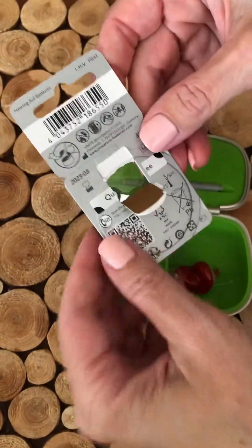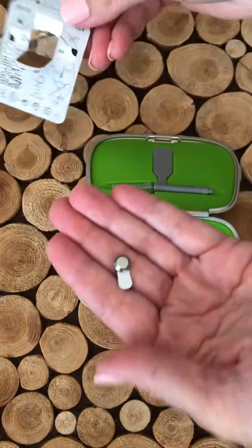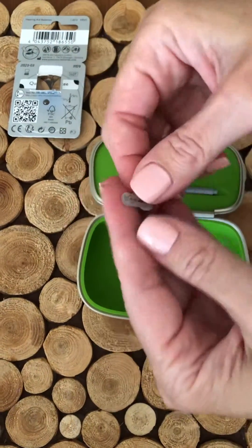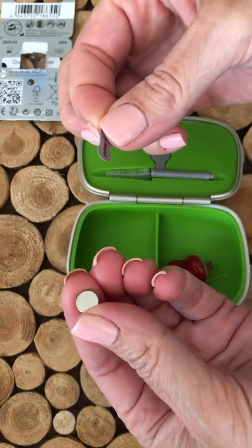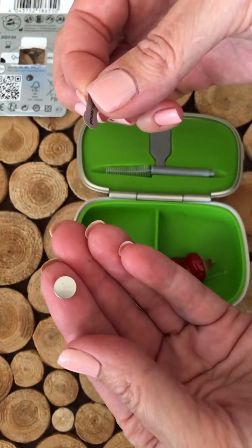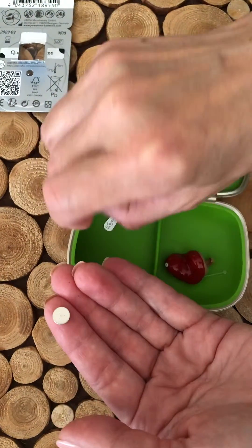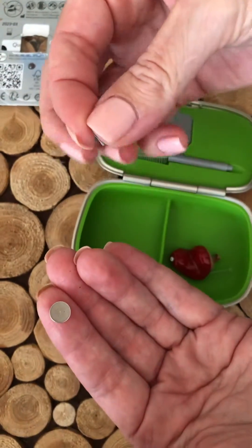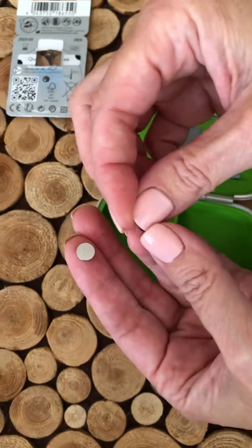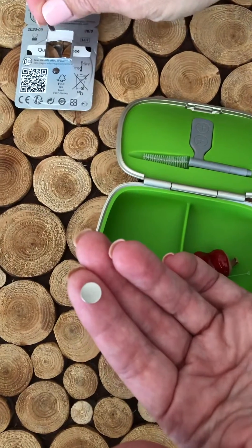If I turn the packet around and remove the battery, you can take the sticker off. Once you take the sticker off, it's activating the battery, so you may want to let it sit for a little bit — a minute or so. You can dispose of the sticker, or you can put it on a calendar every time you change the battery. That way it will let you know how long a battery life you're getting with your hearing aids.